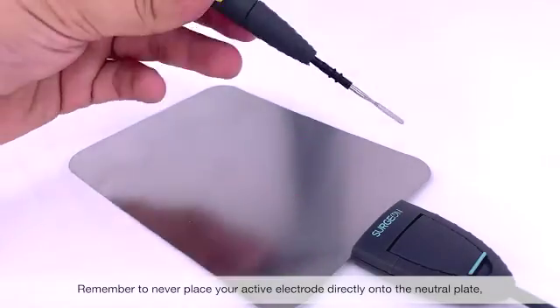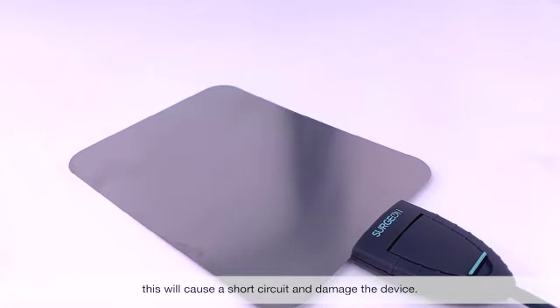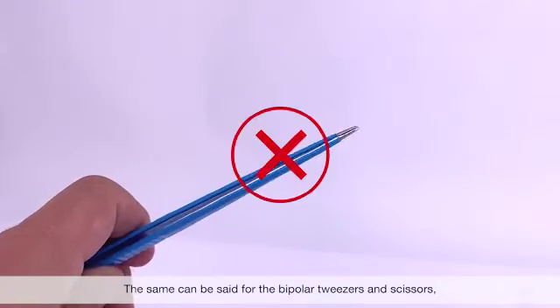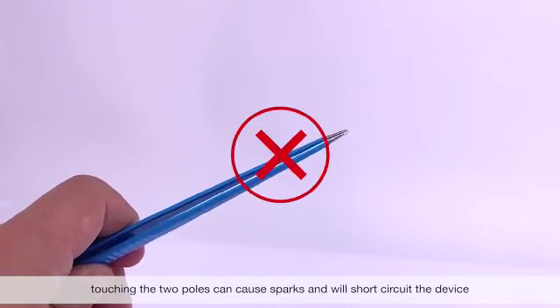Remember to never place the active handle directly onto the neutral plate. This will short circuit the device and cause internal damage. The same applies to bipolar tweezers and scissors — touching the two poles can cause sparks and will short circuit the device.